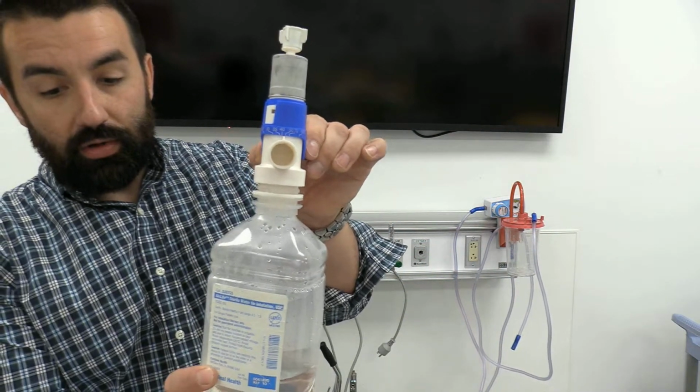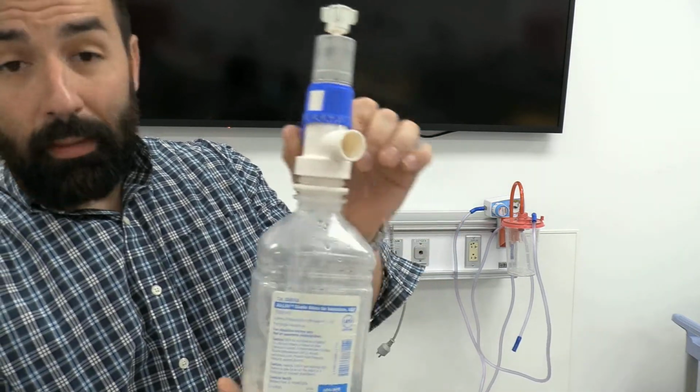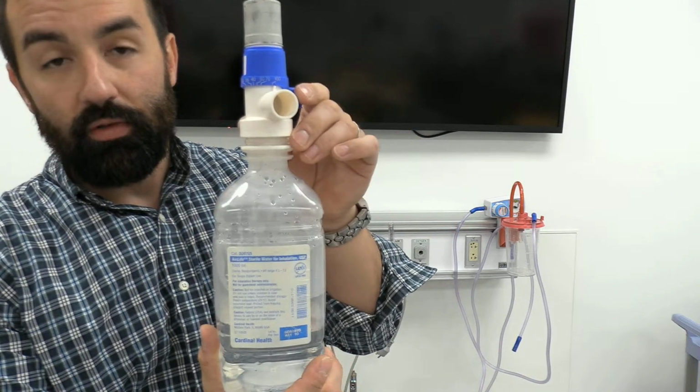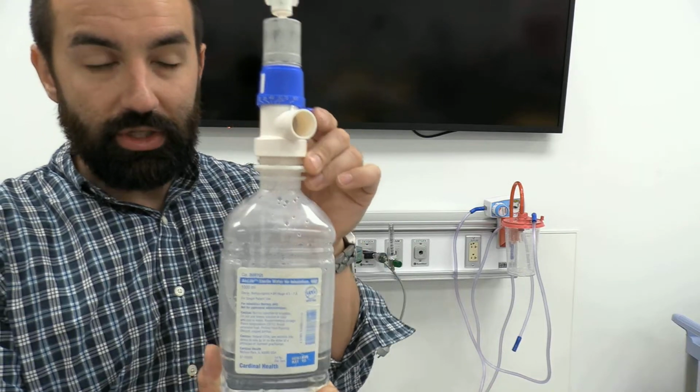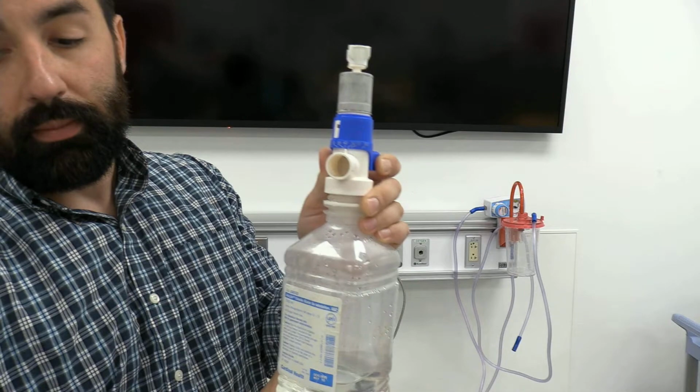You'll get a lot of calls in your career where, oh, they're desaturating. I've even followed therapists that do this. I bumped them up to 70% FiO2 or even 100%, and their sats aren't improving or anything. We've got to think about the entrainment ratios associated with that. And ultimately, what I'll tell you is the higher we start going above 40%, the more trouble we're going to have delivering this as a truly high flow format.